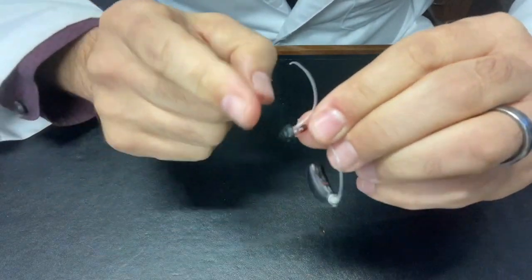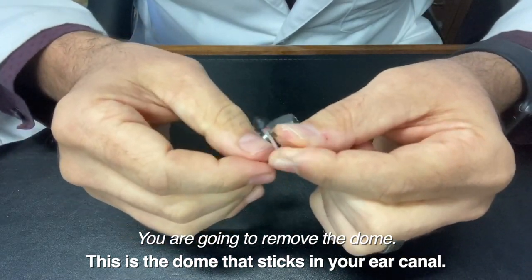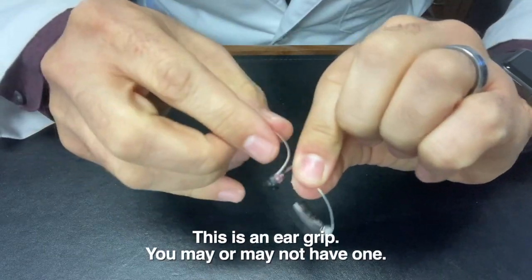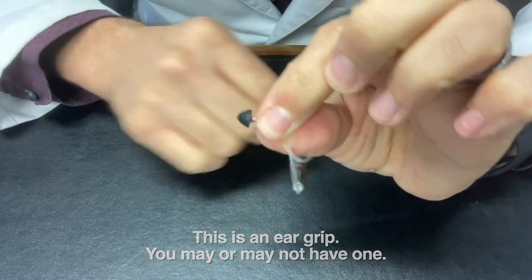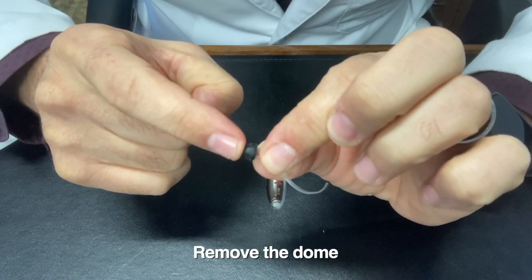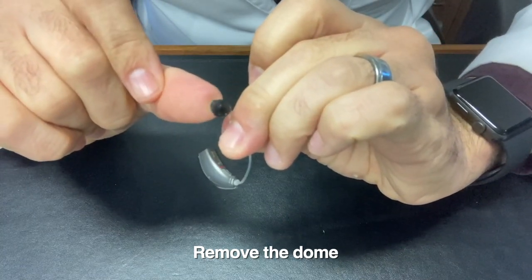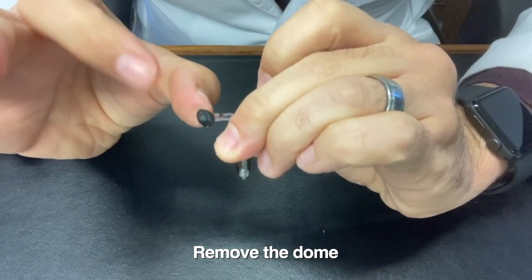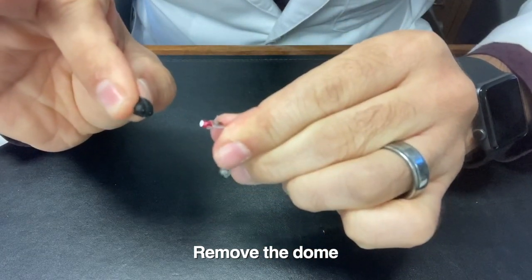The next thing we're going to do is take off the dome. The dome is the part that actually sticks in your ear. Now you may or may not have this extra wire hanging off here. If you do, you might want to just pull it down a little bit and get it out of the way. The way that I take this dome off is I put my fingertip right on the tip of the dome, and then I work a thumb underneath this material here. With my pincher fingers, I have the tip of my finger on the tip and my thumb under this — grab as much material as possible and just pull it right off.